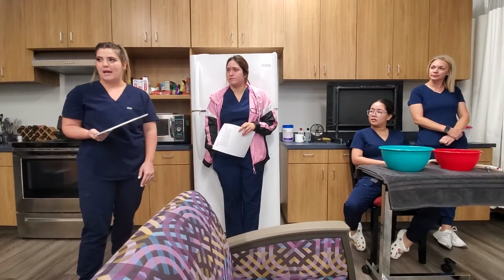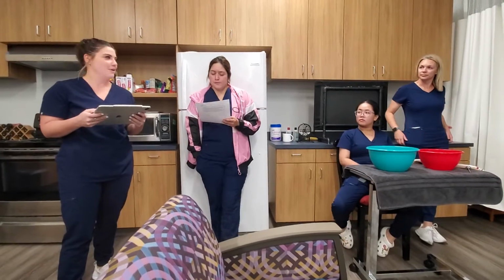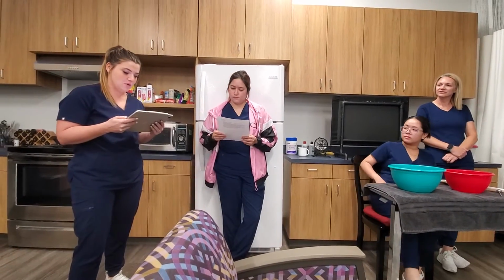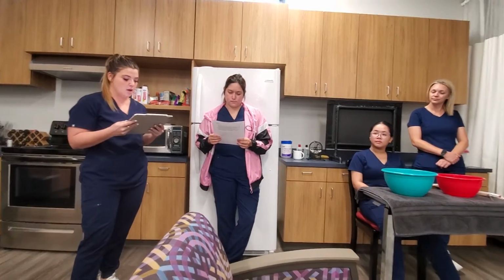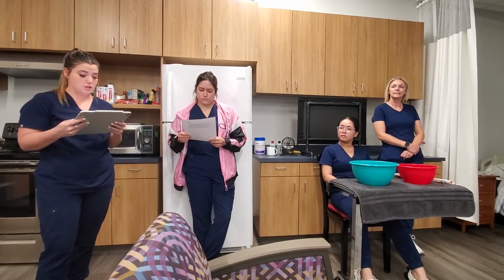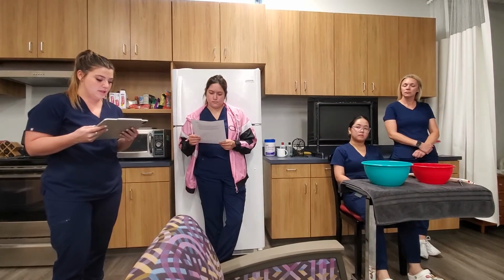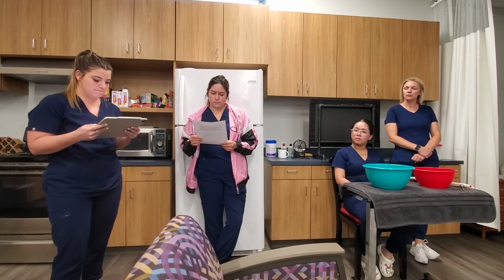Modality is contrast baths, so that's what we will be doing, and I'm going to start us off with our paper. Okay. So contrast baths are a physical agent modality, or PAM, that involves alternating between hot and cold baths. Alternating between the hot and cold baths will cause vasodilation or vasoconstriction, depending on the temperature of the bath to the affected area. Vasodilation and vasoconstriction can increase local blood circulation.